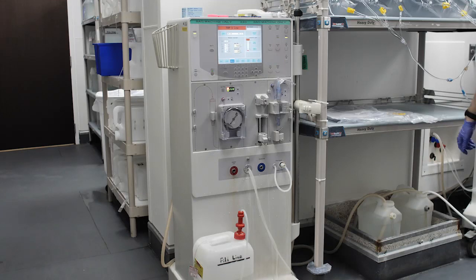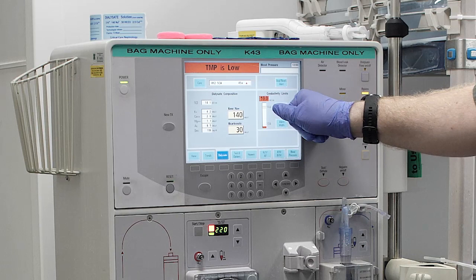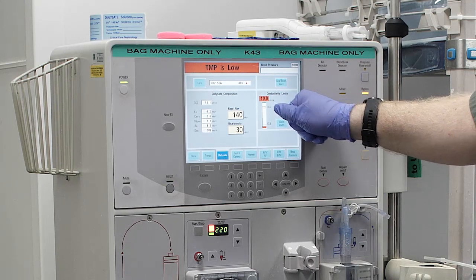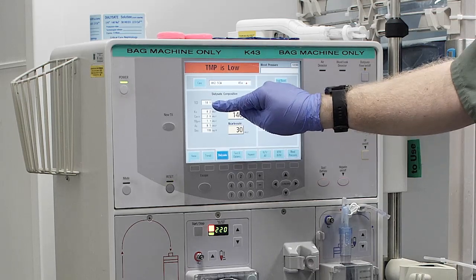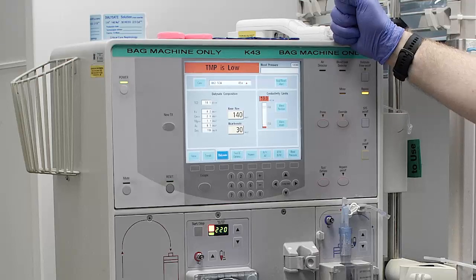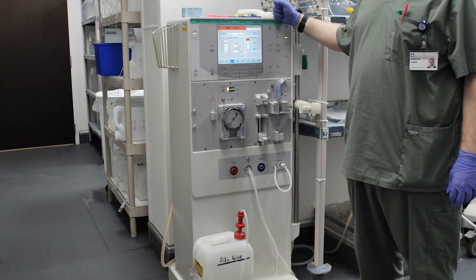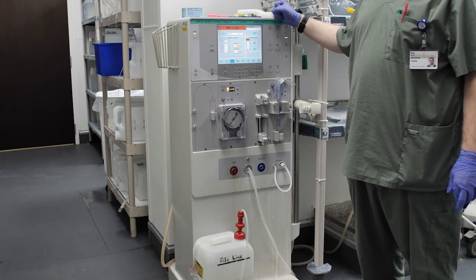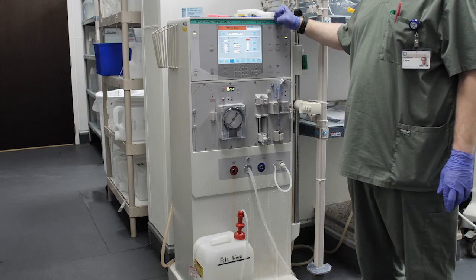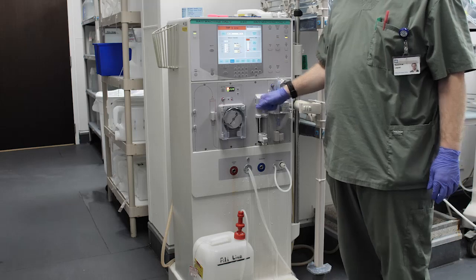Step 1: Bring the dialysis machine up to conductivity with the desired ionic composition. Make sure the conductivity limits are plus or minus 5 of the theoretical conductivity. If using a portable reverse osmosis system, chlorine and chloramine testing needs to be done prior to system startup and redone at a maximum of every 4 hours while in use. Document readings on the dialysate preparation log sheet.